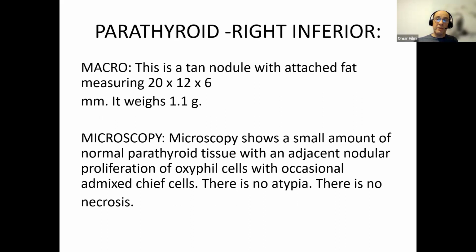And my learning point for this particular case was, in more difficult operations, in complex cases, go sooner to IOPTH and don't just rely on dual localization. Because I really didn't want to have to go back in a second time with this lady, but we were forced into it.